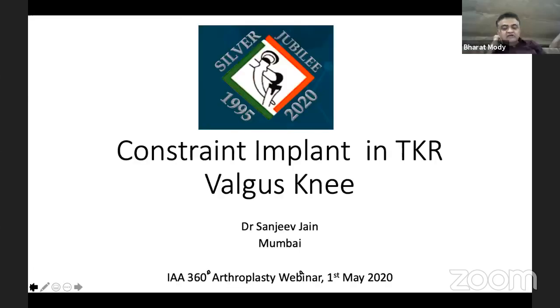Rajesh, I have a question for you to understand the technical aspect of your sliding osteotomy. You showed that you put those wires from the box cut that you do. So does that mean that you don't cement, because you showed the definitive implant in place in this case, or when you pass the wire before, what is the exact sequence?